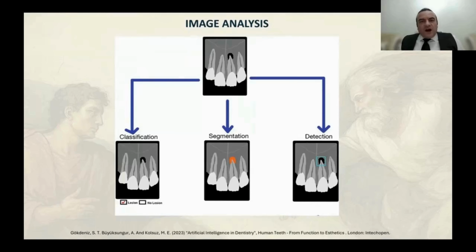So how are these deep learning methodologies used in images? In image analysis, first we can make the segmentation, and from the segmentation we can make object detection and also classify. One step forward, we can also make predictions out of our data.